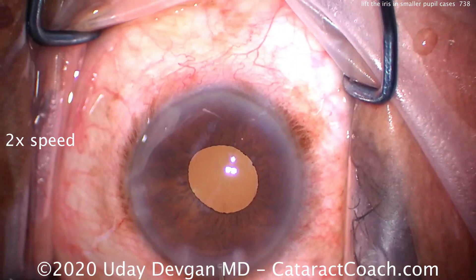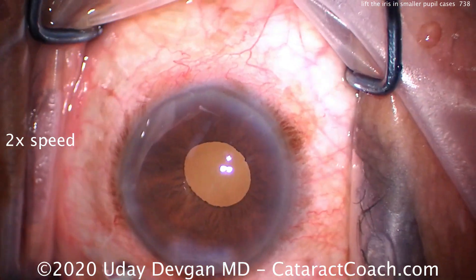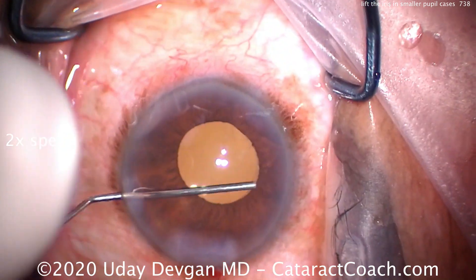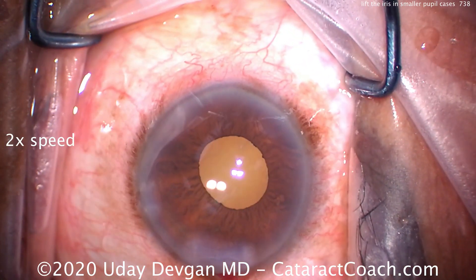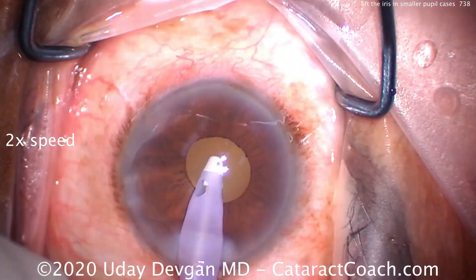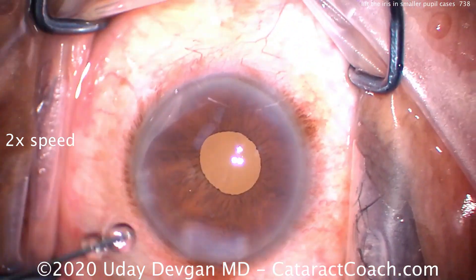Remember, if you leave a little bit of cortex there in the capsular bag, it swells overnight. And by the next morning on post-op day one when you see the patient, that little piece of cortex is going to become a big fluffy piece of hydrated cortex. And if it's a nuclear chip, you're probably going to have to go back inside the eye to remove it.